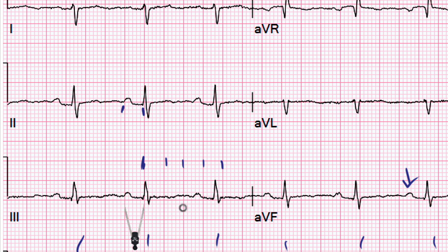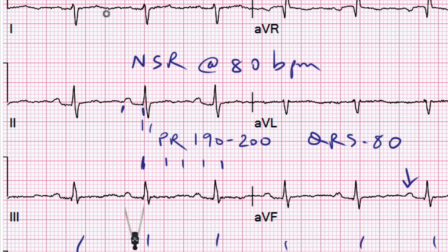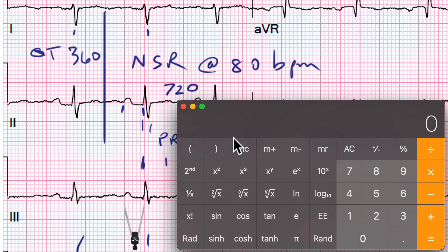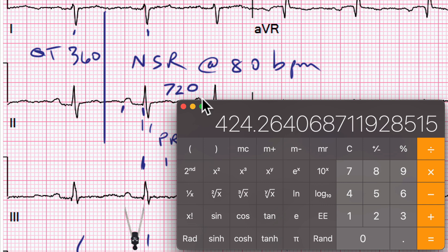The QRS looks quite narrow — it seems to only be about two small boxes wide, so it's fair to call this a normal sinus rhythm at 80 beats per minute, with a PR of 190 to 200, still in a normal range. The QRS we'll call 80 milliseconds. If we measure the QT interval, the T-wave probably ends around here, and remember that if it goes past the midline between two QRS complexes, it's likely abnormal. In this case it's not quite two large boxes, so we'll call the QT interval 360ms. The R-to-R interval is 720ms, and using Bazett's formula — QTc equals QT divided by the square root of the R-to-R in seconds — that's 360 divided by the square root of 0.72, giving us 424 milliseconds, which is a perfectly normal corrected QT interval.